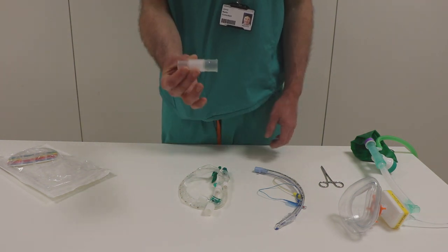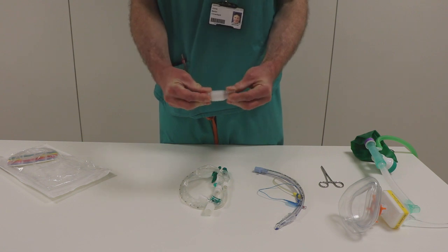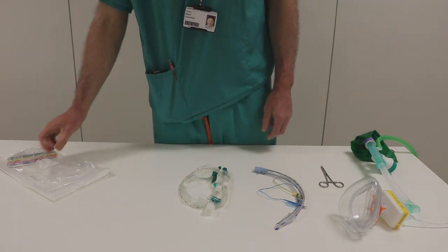In the package you'll find this adapter. We don't particularly like it because it's quite ill-fitting, it's slippy, and it comes off a lot, so we won't use it.